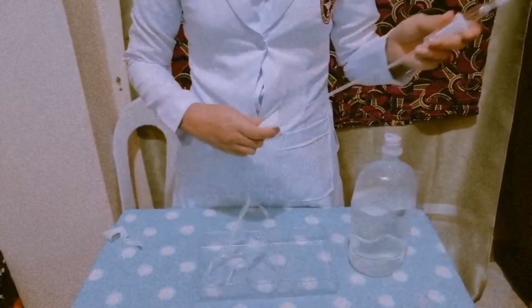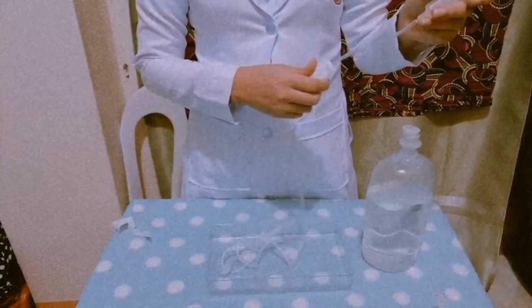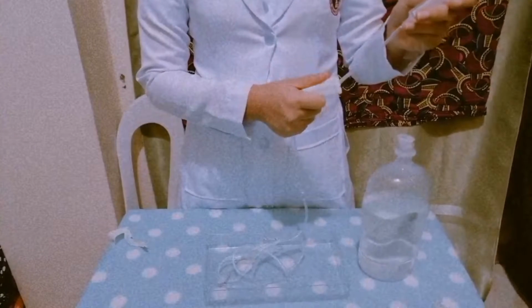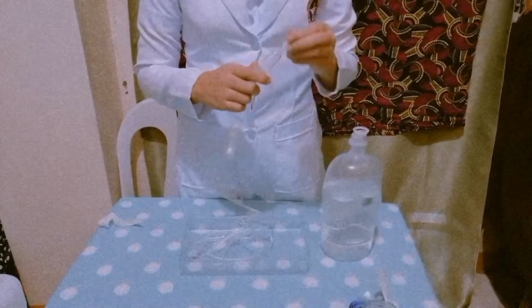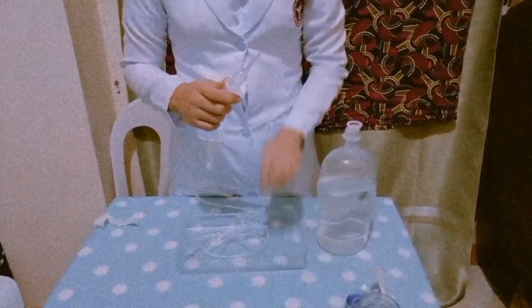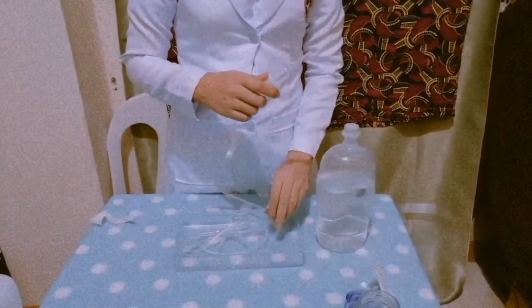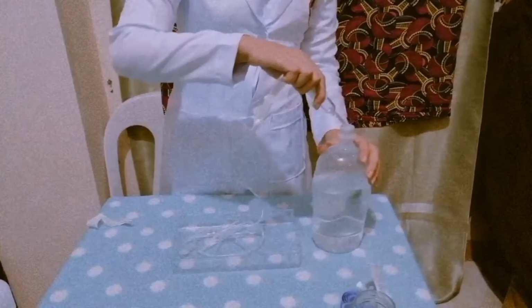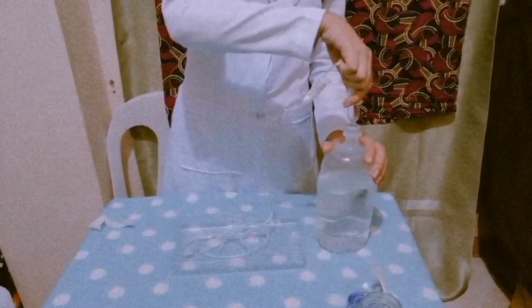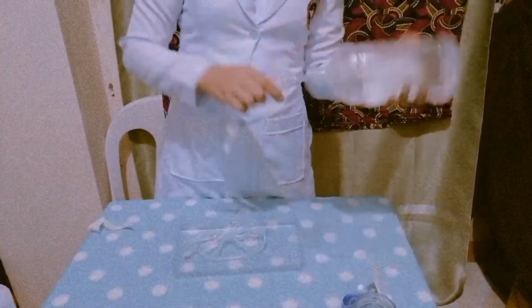Check IV tube for kinks because kinks or bends in tubing may decrease or stop the flow of IV fluids. Clamp tubing, uncap the spike and insert it into the entry site of the bag or bottle as the manufacturer directs. If an additive is ordered, incorporate it before inserting the spike into the entry site. This punctures the seal in the IV bag or bottle.